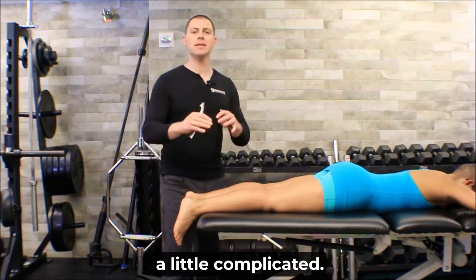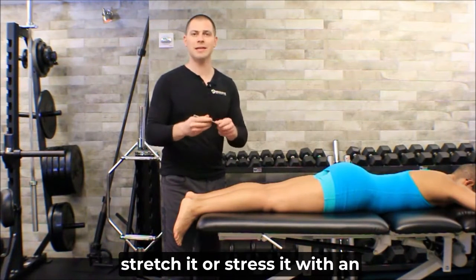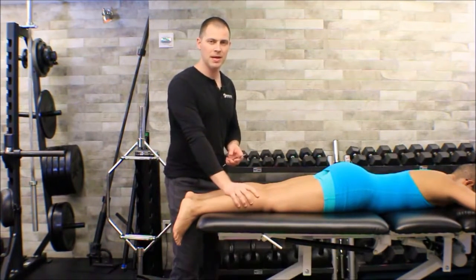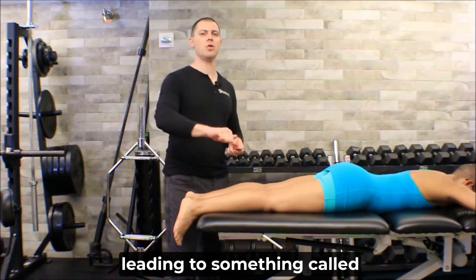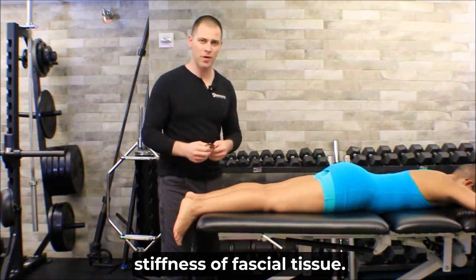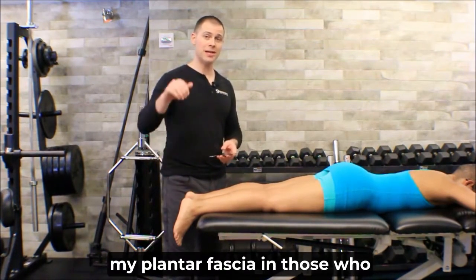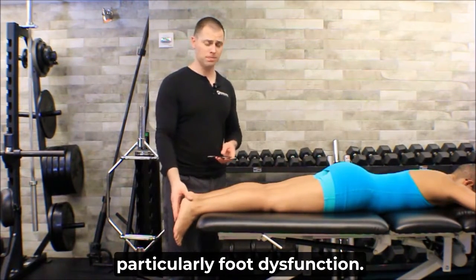And this is where things get a little complicated. What happens to fascia when we stretch it or stress it with an IASTM tool is not the same thing that happens when we stretch or release a muscle. In fact, there's some research to point to repetitive stretching leading to something called strain hardening, which actually increases the stiffness of fascial tissue. And if I think about increased stiffness, that could be a good thing for my plantar fascia in those who have lower extremity and particularly foot dysfunction.